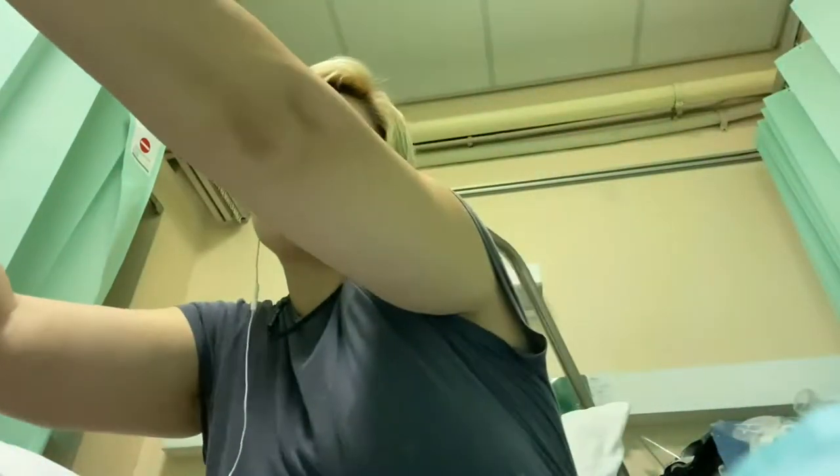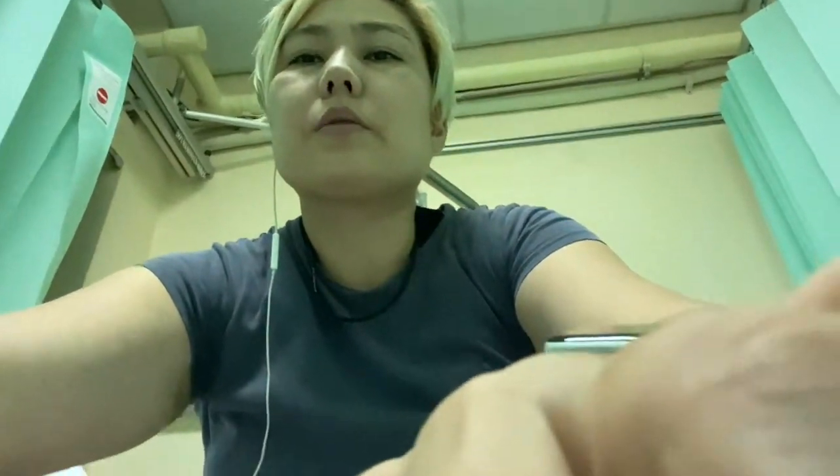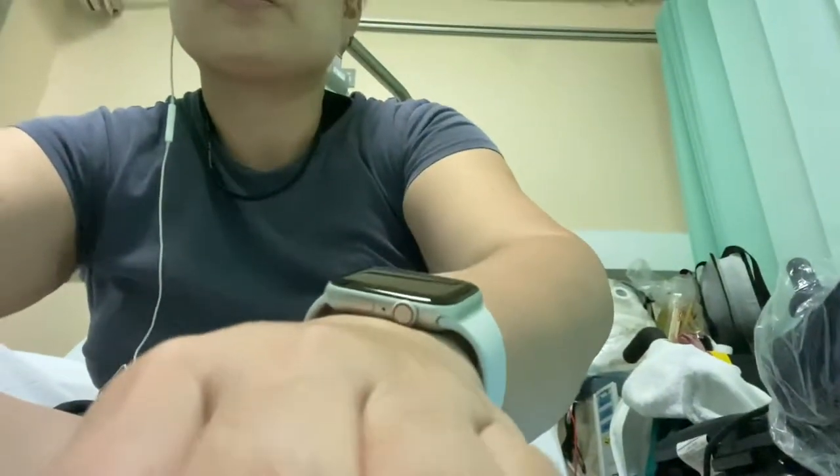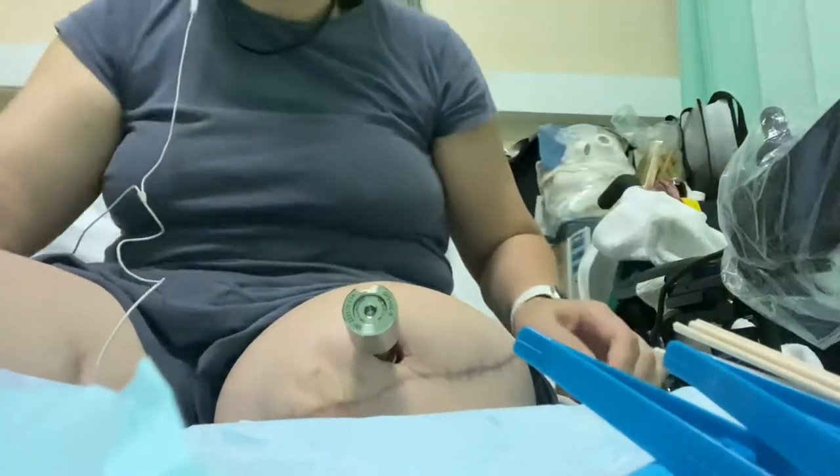Okay, ready here. I have to clean my hands one more time before I start. I want to change the angle a little bit to my left side so you guys can see, but I cannot see my face anymore. Okay, here — can you guys see?